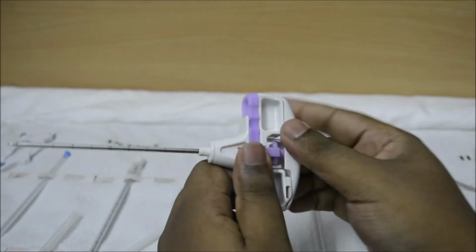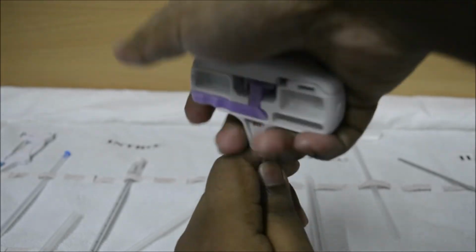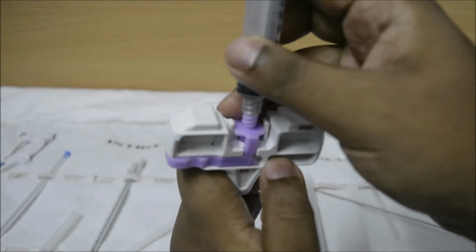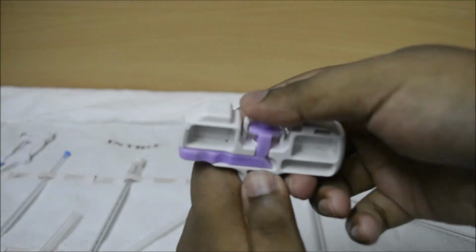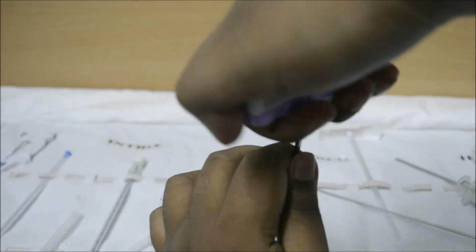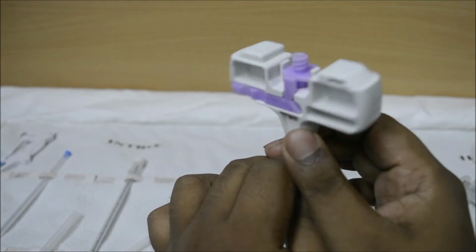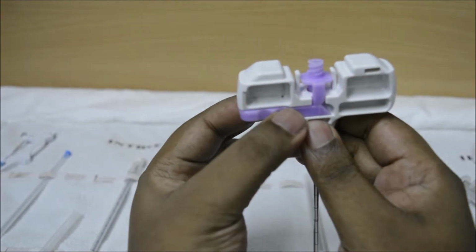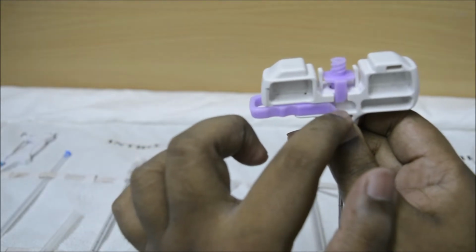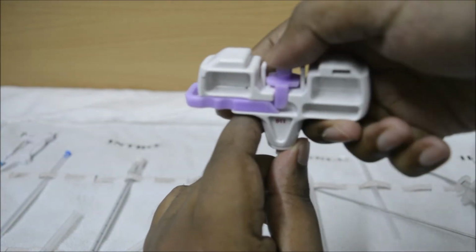First, as you all know, the doctor has to identify how much to push it inside. Then the stylet is removed. At this point, if the doctor wishes to perform aspiration, he or she can, using the Luer lock syringe. After which, the doctor pushes inside to collect the solid bone marrow. Again, trephining is done like this, this and this. As I explained previously, using that 180 degree movement, trephining is done. After which, the small violet part is pulled apart to make this small cavity. Now this specimen collecting stylet is pushed further like this.